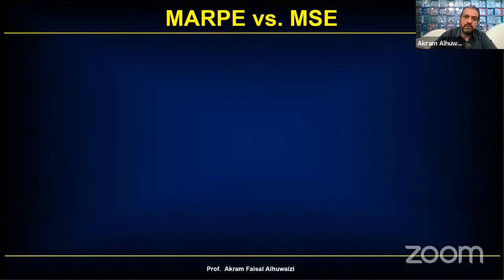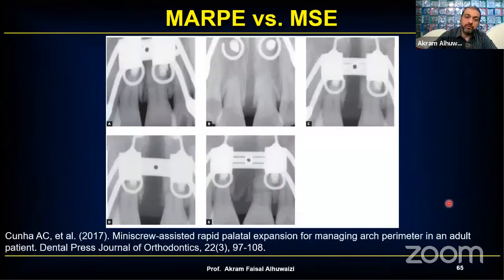So what's the difference? Well, before all of them, the similarity of them, all of them open up the suture. All of them leave this radiolucency, and there's no bone.